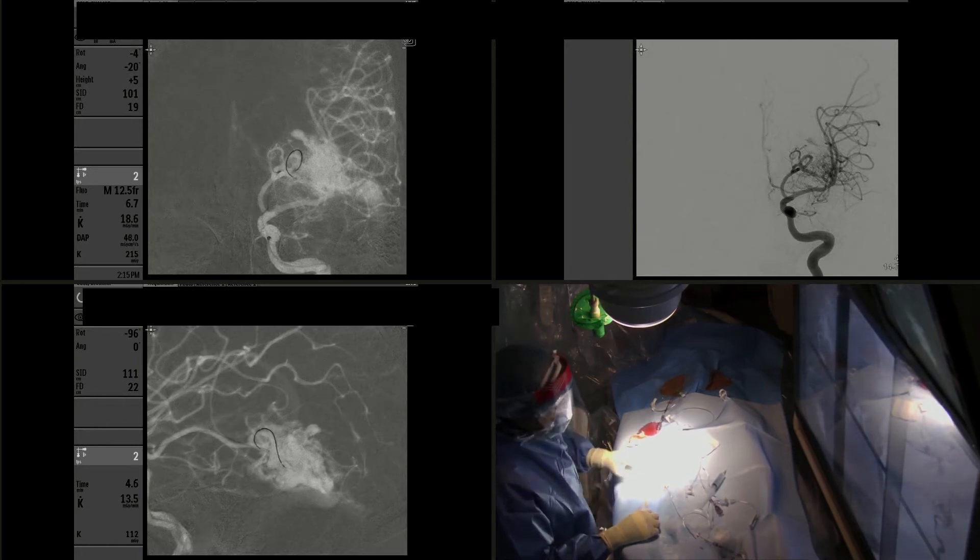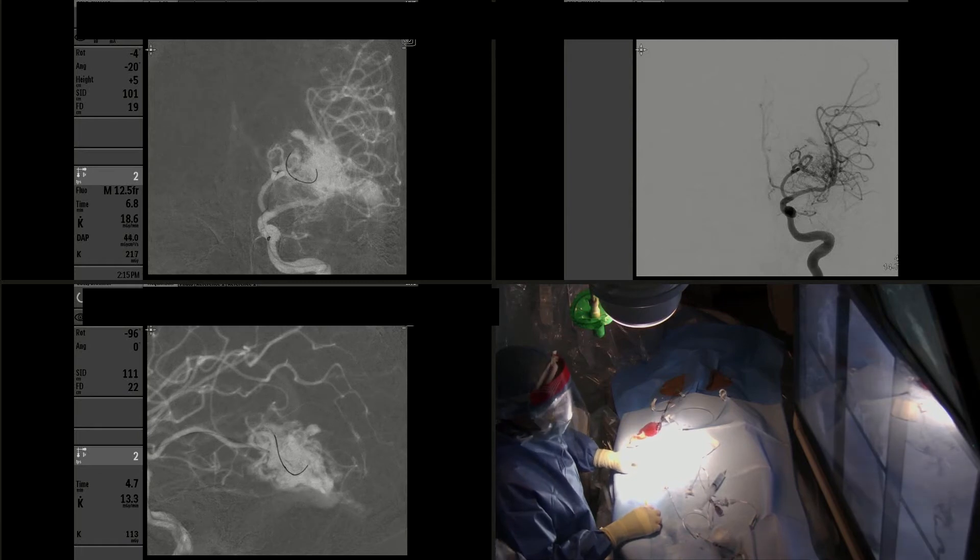You can see how we are advancing the microcatheter into the region in the middle of the arteriovenous malformation nidus.